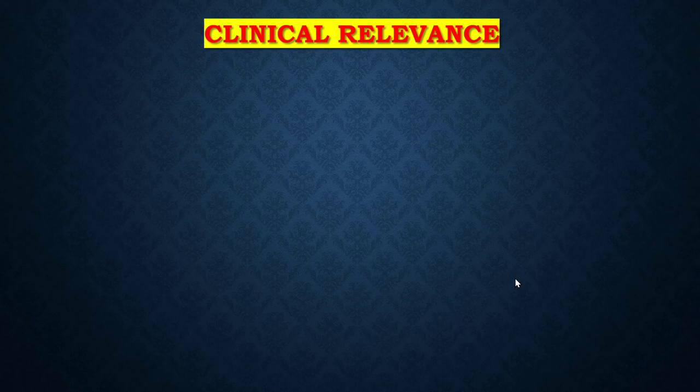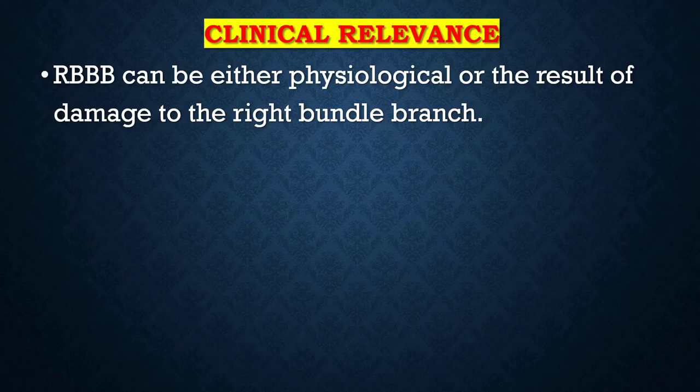Clinical relevance of right bundle branch block. Right bundle branch block can be either physiological or the result of damage to the right bundle branch.